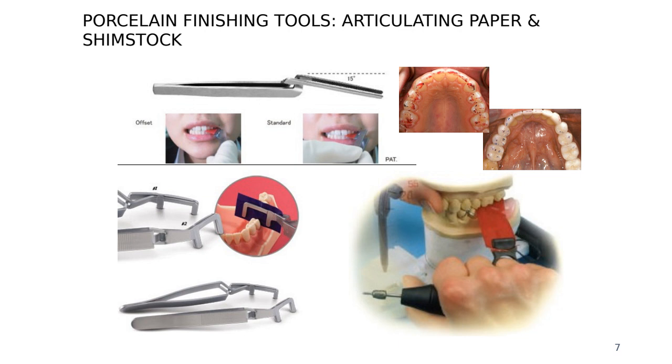It's not just having the tools. If you don't know what to do with them, it looks nice that you have them, but it doesn't mean too much, right? So it's very important to see and understand where the contacts should be on each tooth. And you learn this in tooth morphology, right?